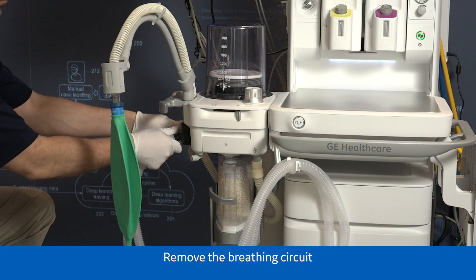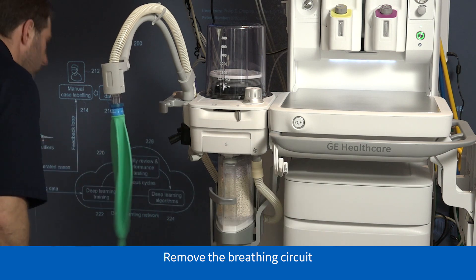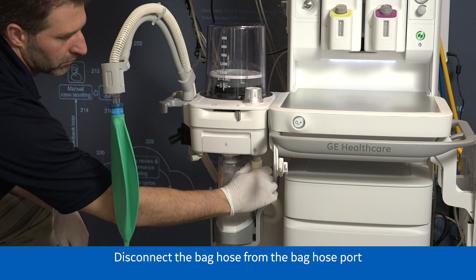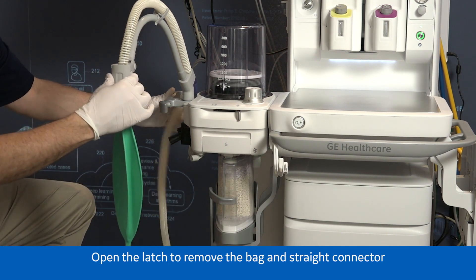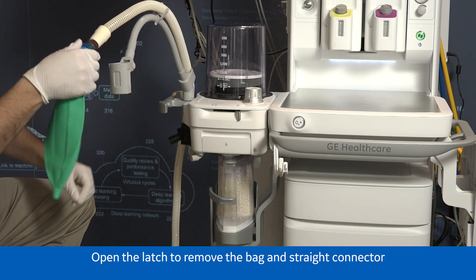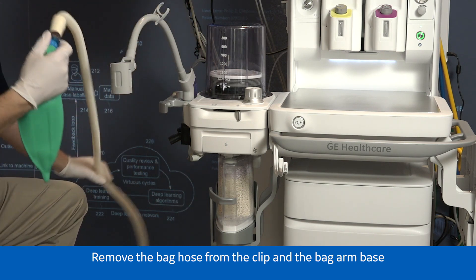Remove the breathing circuit. Disconnect the bag hose from the bag hose port. Open the latch to remove the bag and straight connector. Remove the bag hose from the clip and the bag arm base.